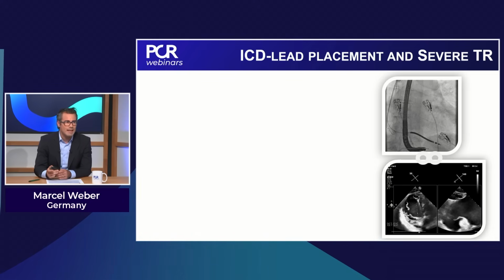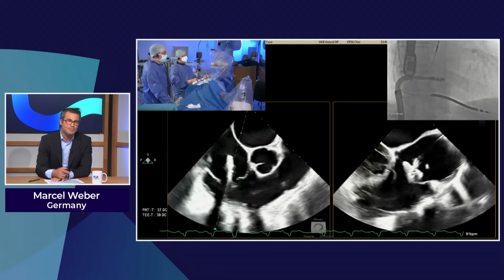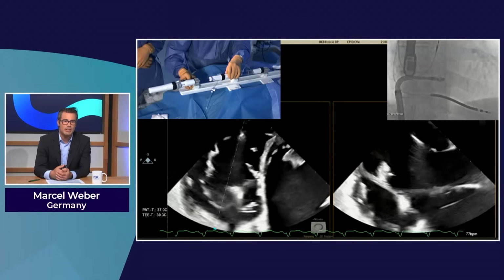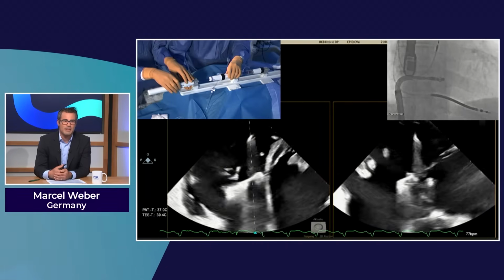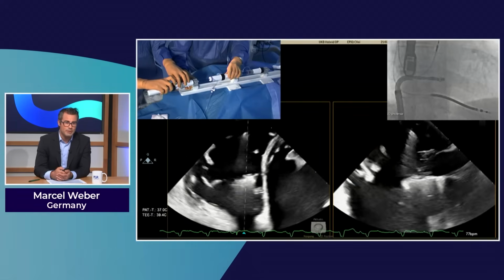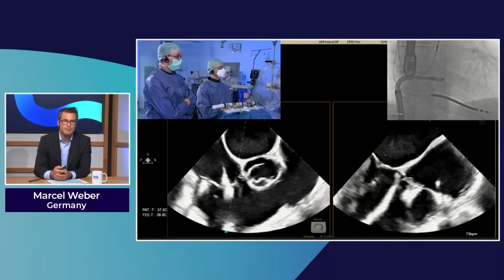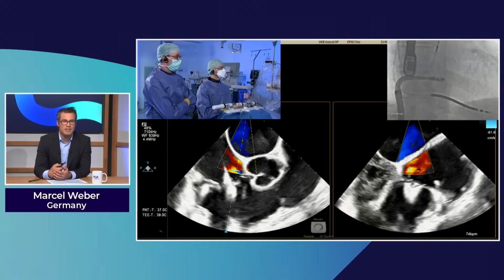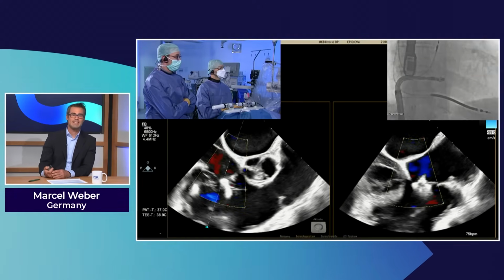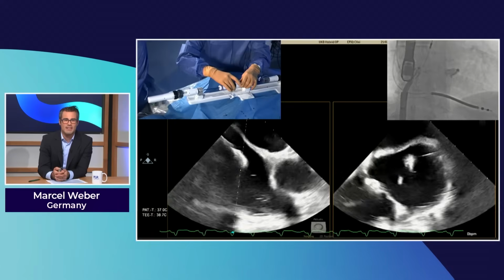And then on the next day, we went to the tricuspid TEER procedure. I want to show it here. We showed it as a live case, and you see a Pascal implantation. It's time-lapse, so it's very fast. First position was, again, transgastric and anteroseptal, and you see how nicely the leaflets come together with the first Pascal system, and it was still a central TR, as you can see here in the image, and we placed a second device just beside it.